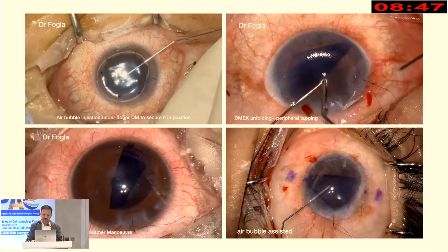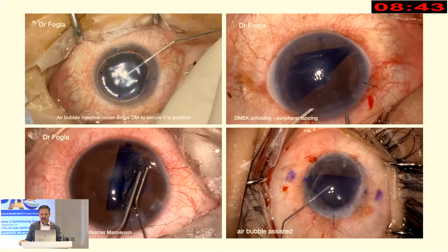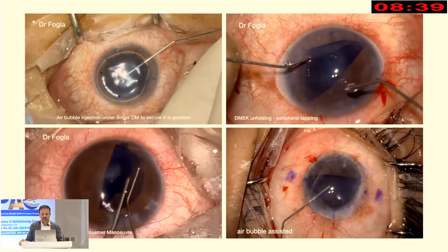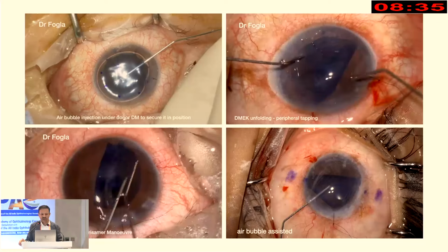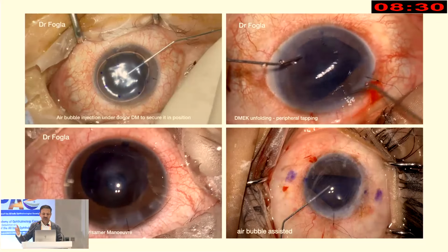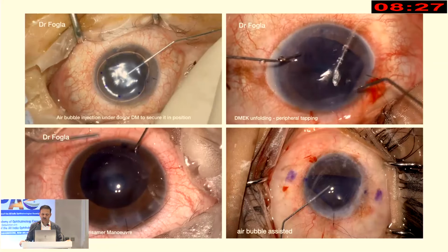And then you can use the same principles to open it. If you have a tighter scroll or a younger scroll, then you use the drum roll technique or the Dirisammer maneuver, where you pin down one edge of the DM scroll, and then using the second cannula, like a carpet unrolling maneuver, you continuously tap from inside and outside and you can get the scroll to open up.